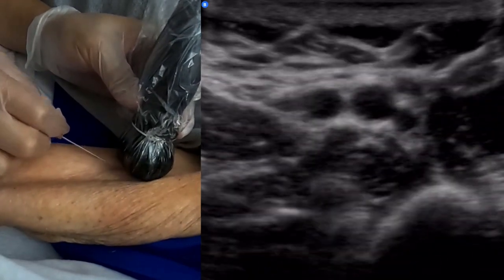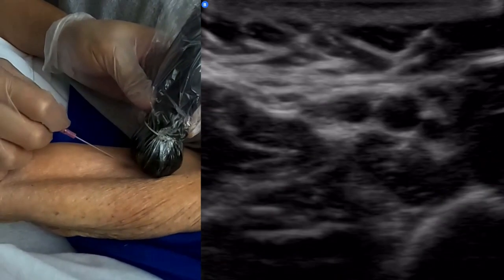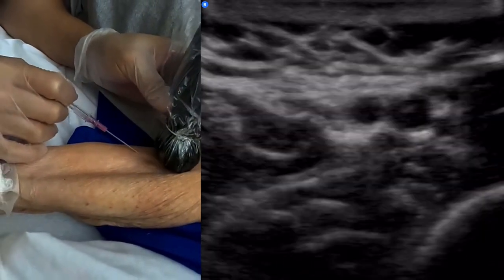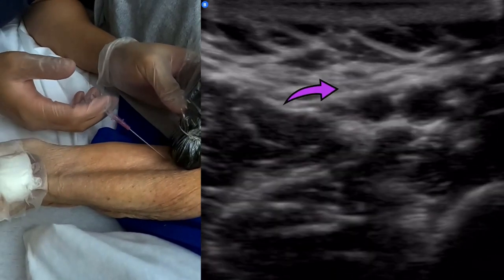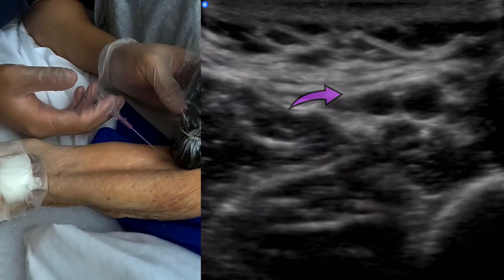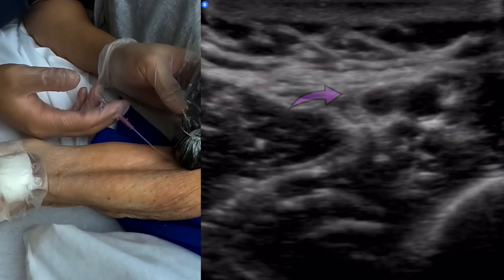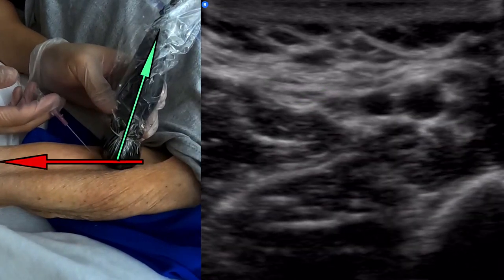All right, so from here, it's hard to tell where my needle tip is, right? Notice I'm changing my hand positioning and how I'm holding the needle to accommodate for this location. So I'm looking for shifting in the tissue. So I see shifting there. I don't see shifting here. So it must be within this millimeter worth of space, okay?